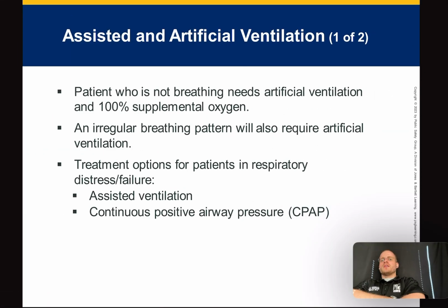So the patient who is not breathing needs artificial ventilation. Artificial ventilations. This guy, right? With 100% supplemental oxygen. So this would connect to the oxygen tank. I'm not unfolding it. And it would supply this bag with a bunch of air. And so when I squeeze this bag, the air would come from this bag, like this bag to that bag. So it's similar to a non-rebreather in that it is pulling in 100% oxygen because you're pulling the air from this reservoir bag. And so this is artificial ventilations, okay?